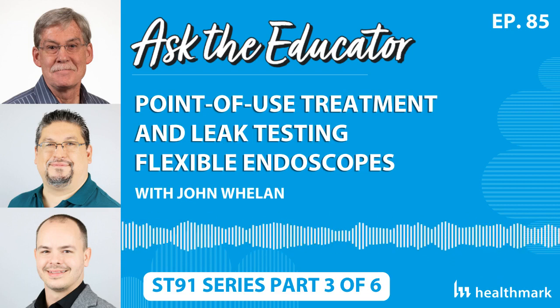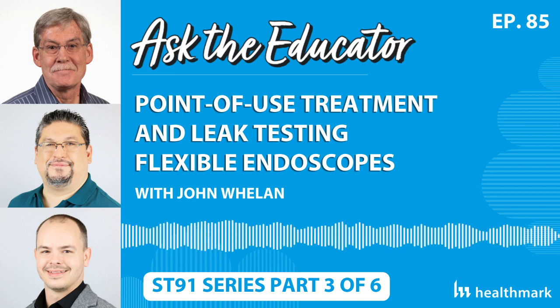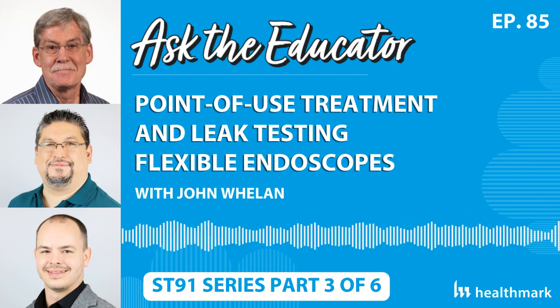The other thing that is reinforcing the way scopes should be transported are the manufacturers. I mean, you're going to damage the scope if you don't transport it in the right way. Carrying it in your hands is not appropriate either direction, soiled or clean. And again, making sure the coiling is appropriate, but it's not just OSHA, but it's the manufacturers that drive this too. Thanks, Adam, for letting me fit that in. Oh, yeah, no problem. Absolutely.